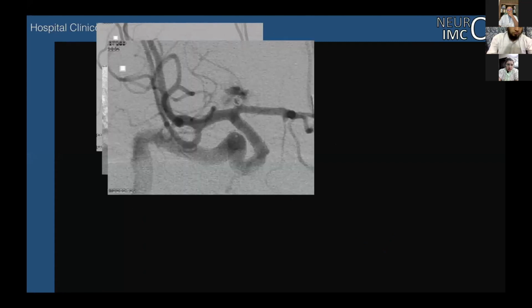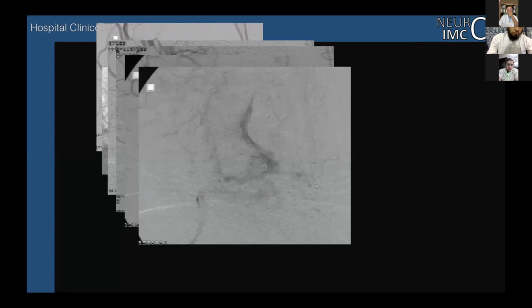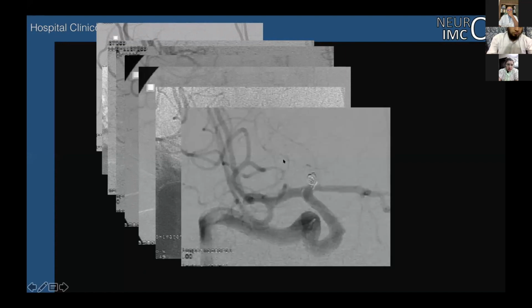One case, rupture of the aneurysm with the coiling. And then very quickly, you inflate the balloon, and you inflate the balloon here. You push some coils and you stop the bleeding. You have the catheter. What is the pointer here? Here the balloon.